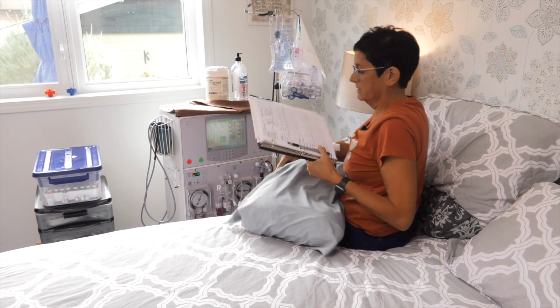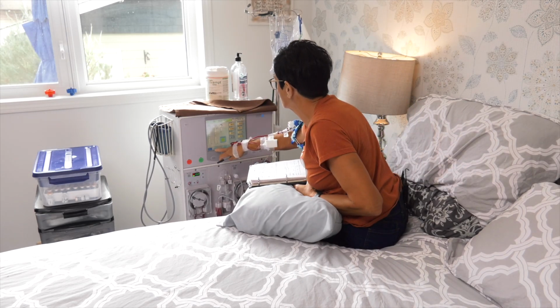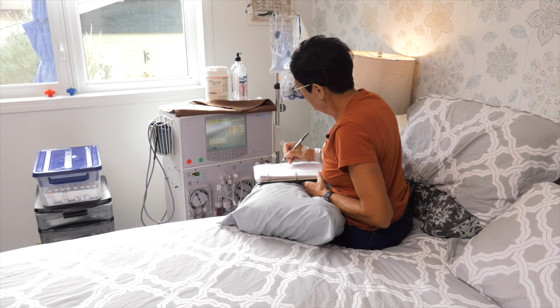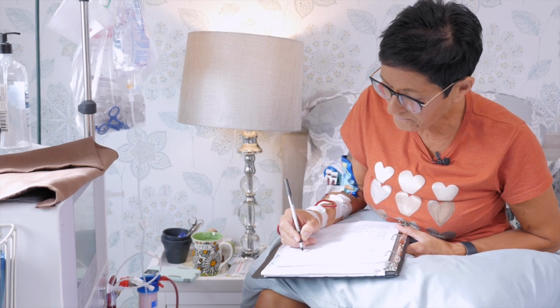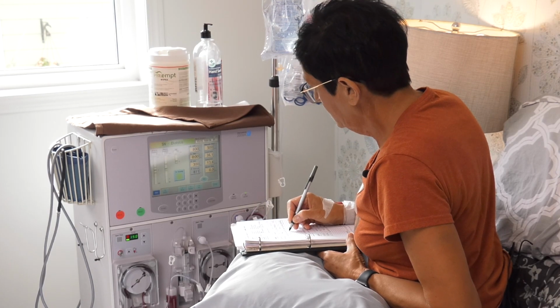So I'm done my treatment. Now I'll record the information that the machine has stored. So I'll go to my treatment history. And I'll record all the time I'm off, blood pump speed.